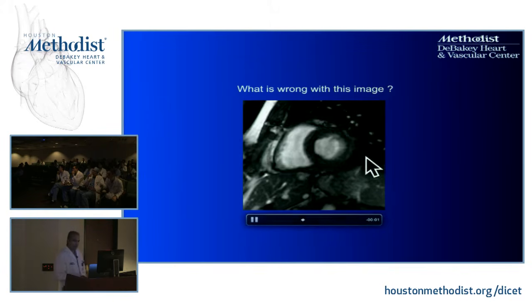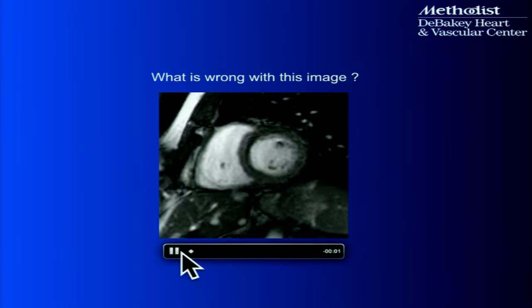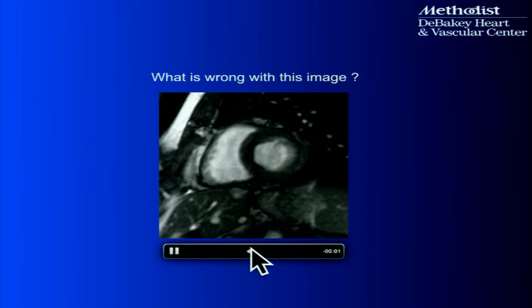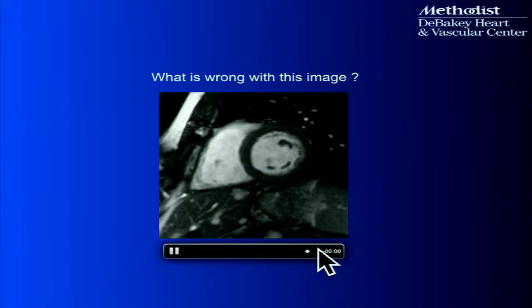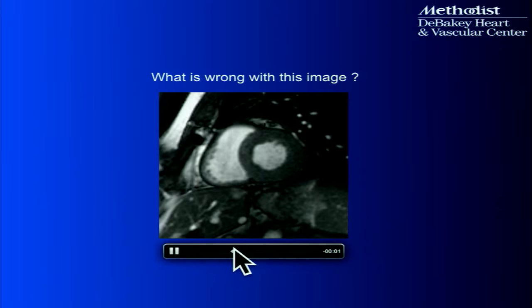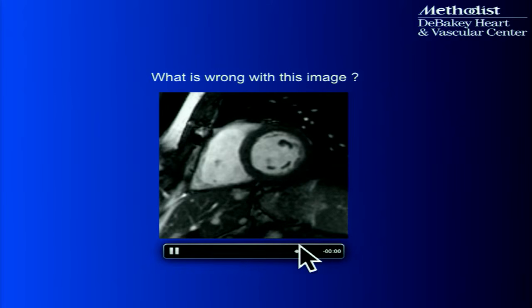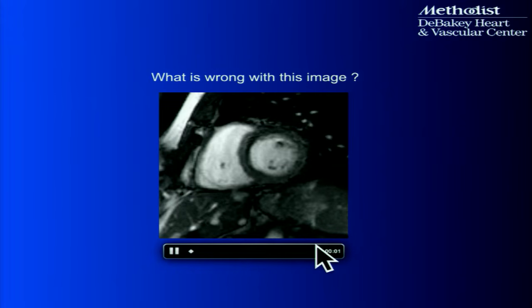If you take a look at this, because also if you look in diastole, how does it look? And let me pause this for you to make it easier. How does this look here? And diastole looks good, right? It's actually during systole when there's movement that it doesn't look very good. It looks blurry, right? And the endocardial borders look blurry. I can't really define the borders that well. This is a problem of frame rate or temporal resolution, okay?